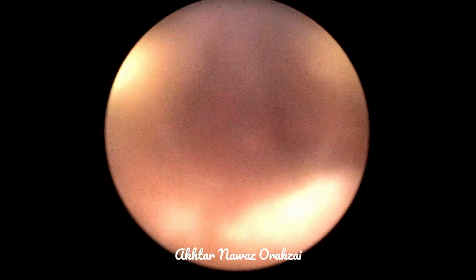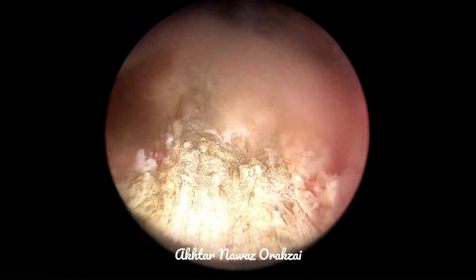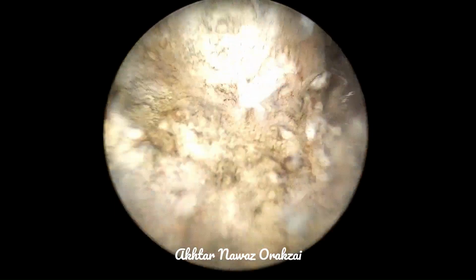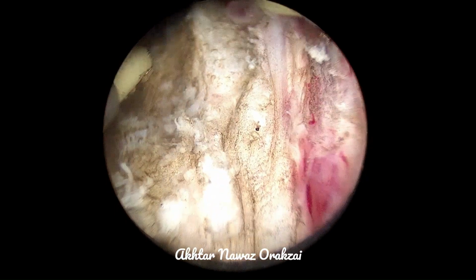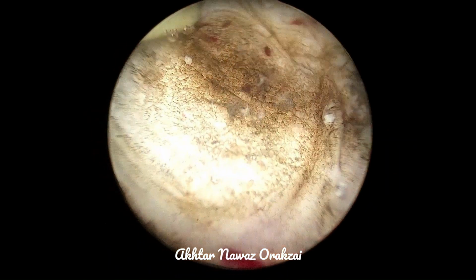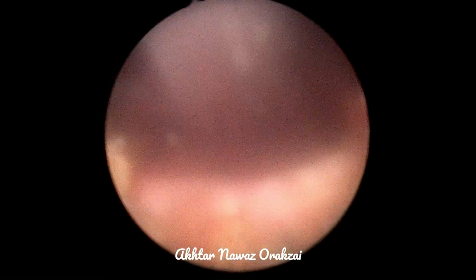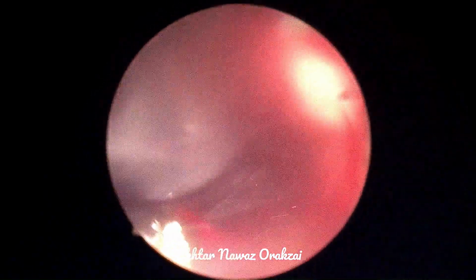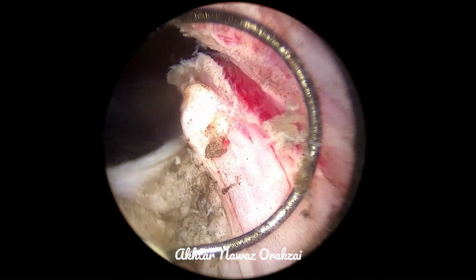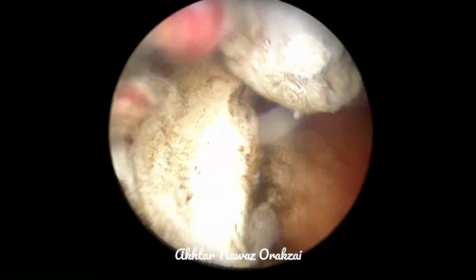The fluid will go in and come out efficiently, and hence the vision will be good, and the procedure will be performed with greater ease. So it will take less time for resection. So this is the routine that I follow. As we saw from the data of the patient, he is a very physically fit patient. He's younger and is worried about erectile dysfunction.